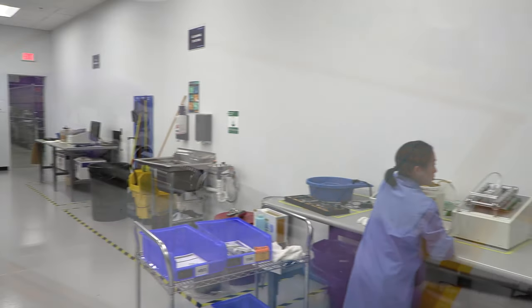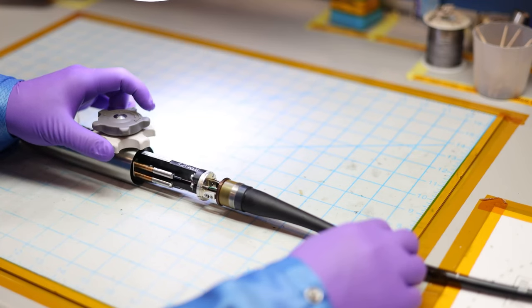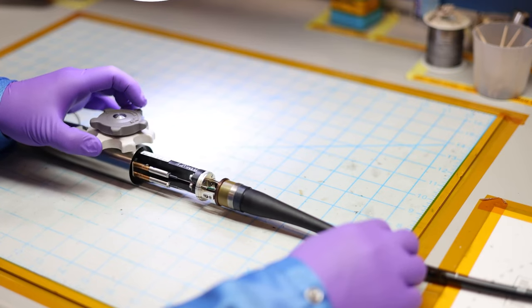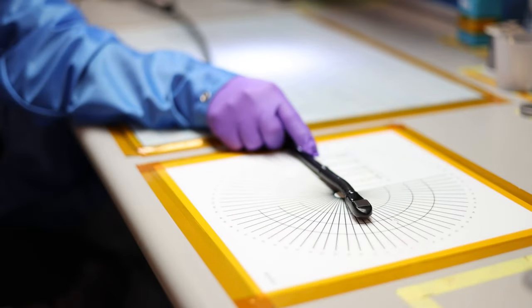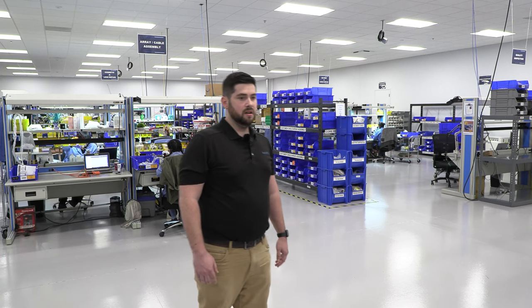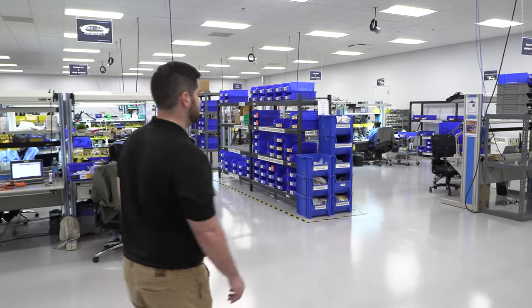So, going into the first step of probe repair, we have the initial inspection process, which we showed a little bit of out there, but there's a little more to it. As probes come in the door, one of the first things we do is disinfect the probe for a second time. The second thing is what I call a lens to pins evaluation, a visual inspection to physically evaluate the probe for any defects. From there, we perform electrical leakage testing to make sure there are no leakage issues. After that, we do our acoustic and electrical integrity testing with our TC3 stations. This is very useful to measure the acoustic sensitivity as well as the electrical capacitance and impedance of various different models.